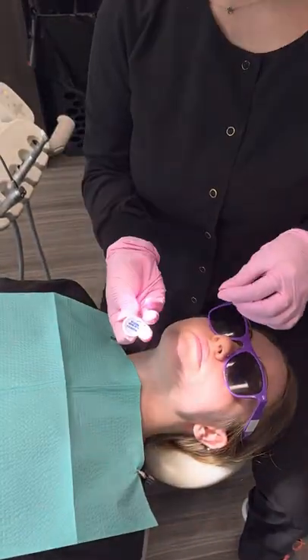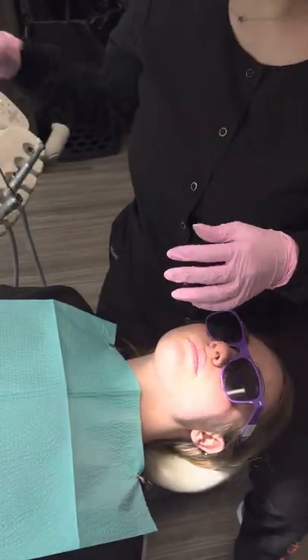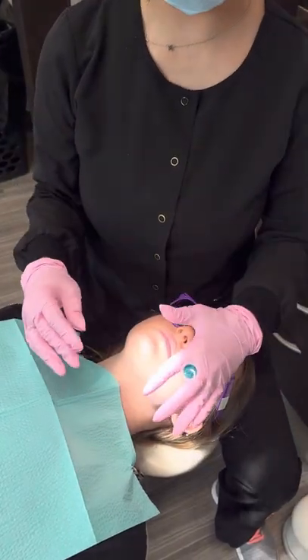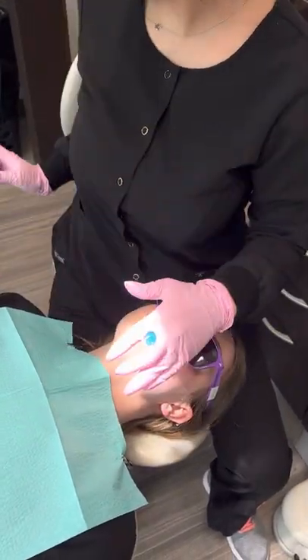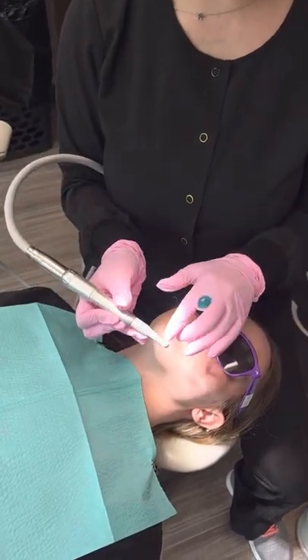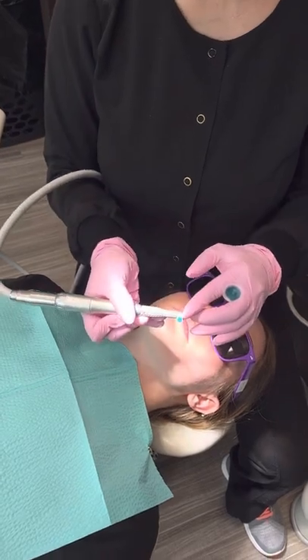After the patient has picked out the prophy paste, we're going to rip off the tab and put the trash to the side. I personally put my prophy paste in between my two index fingers. Then, making sure that our hoses are tucked underneath, I'm going to spin the prophy, pushing the pedal down on the ground to collect some prophy paste.